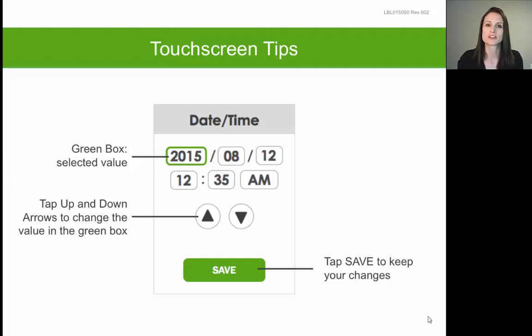One of the first setup screens will ask you to set the date and time, displayed as the year, the month, and the day. To edit any individual field, simply tap on that field so that it's highlighted in green, and then tap the up and down arrow symbol to edit that highlighted field. For example, to edit the year, tap on the year field so it's highlighted in green, then tap the up and down arrow to find the correct year.